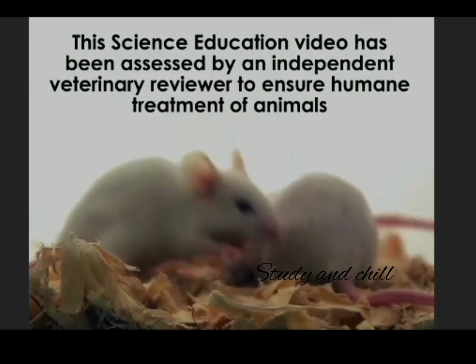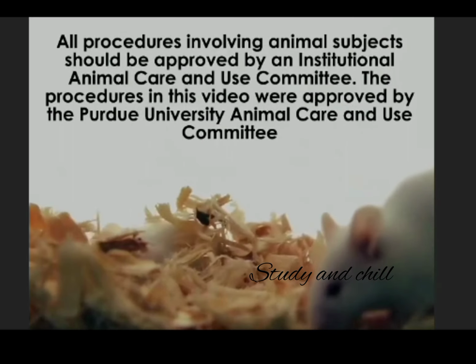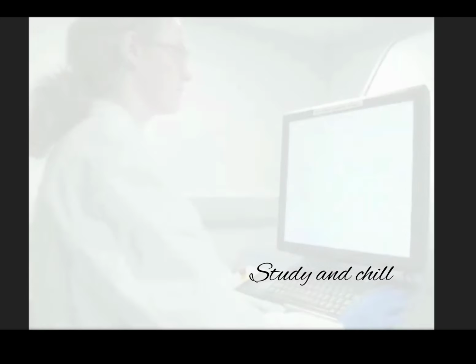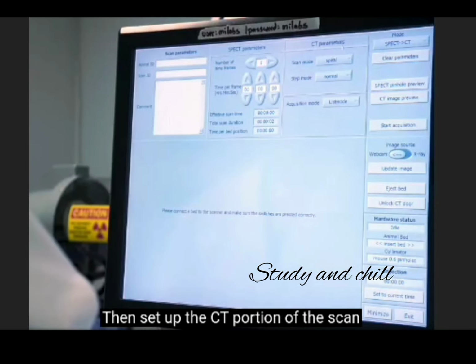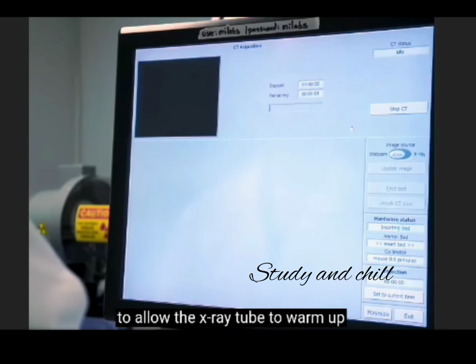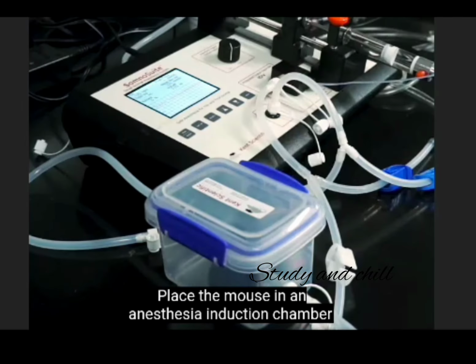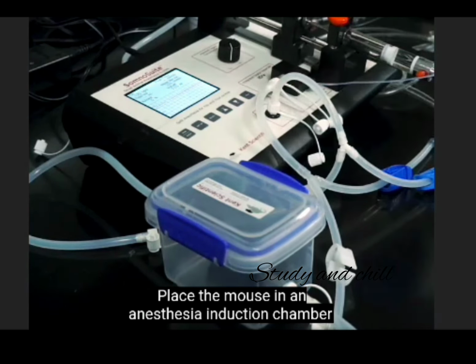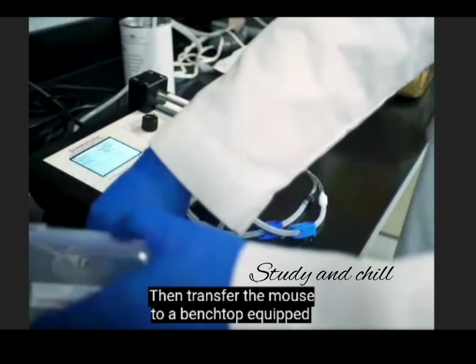First, open the system software. Then, set up the CT portion of the scan to allow the X-ray tube to warm up by selecting the option on the software. The system will begin heating up the tube. Place the mouse in an anesthesia induction chamber and anesthetize the animal using isoflurane. Then transfer the mouse to a bench top equipped with a nose cone. Next, verify that the mouse is unconscious using the toe pinch technique.